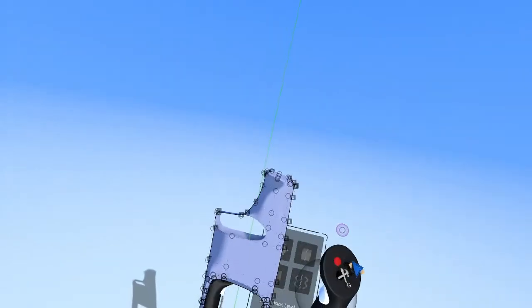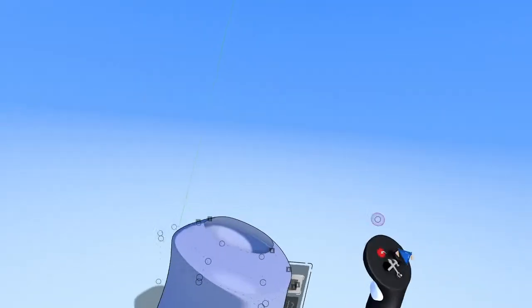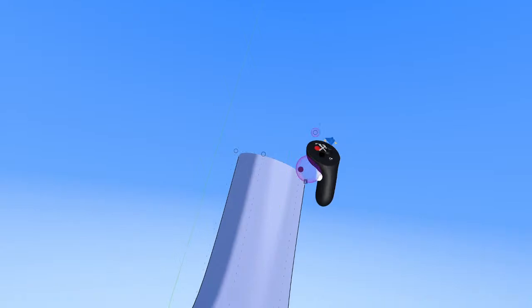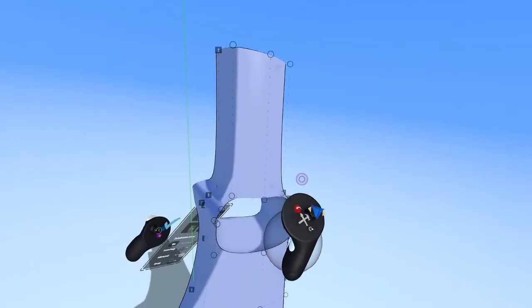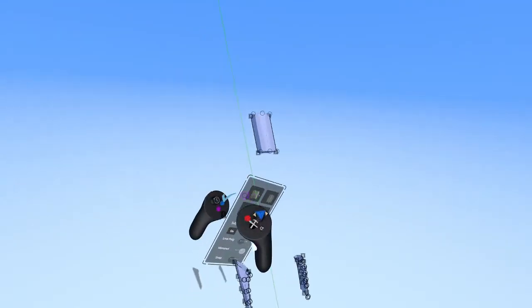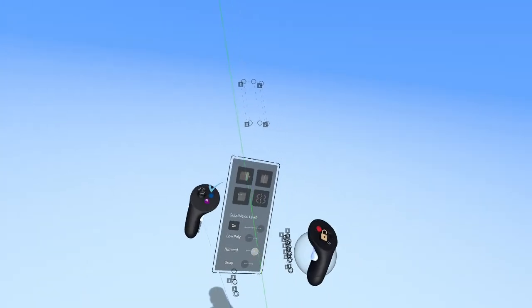I know I want to use the original sub-D shape, but I want it to be separate from the rest of the original shape. So I'm going to turn on auto edge loops, duplicate up a surface like this, and then this might look a little tedious, but I'm actually going to delete away the rest of the geometry here and just use, oh no.